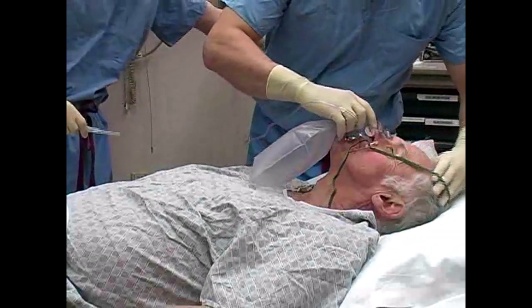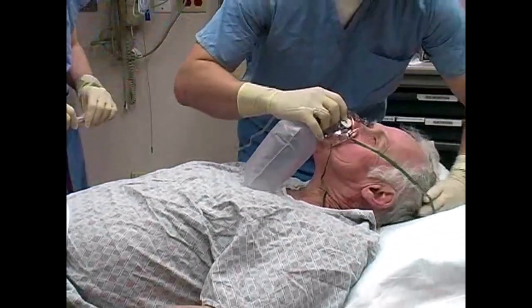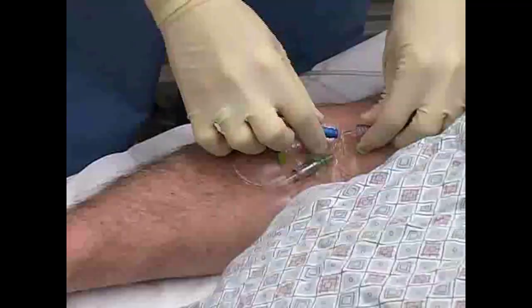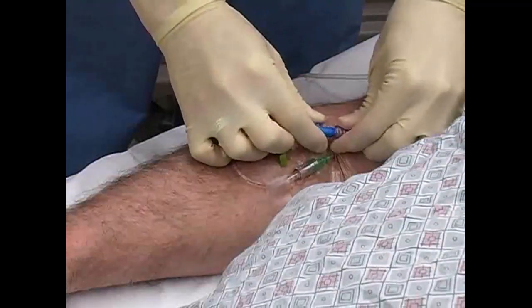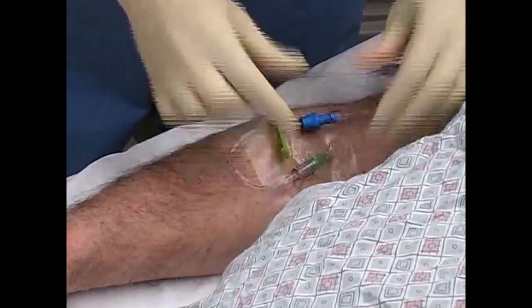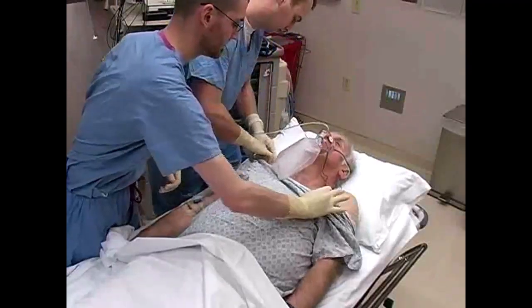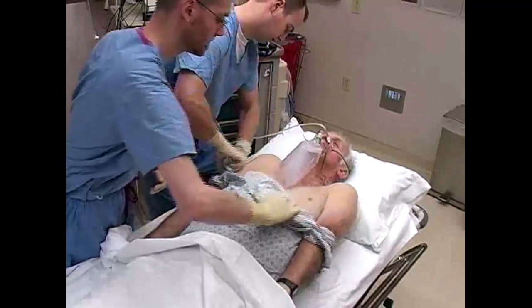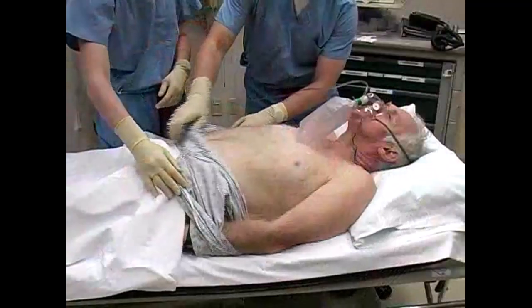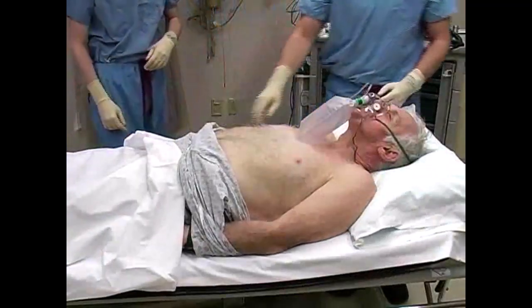Prior to cardioversion, place the patient on oxygen and establish an intravenous line. Expose the patient's chest so that the monitor leads and defibrillation pads may be easily attached.